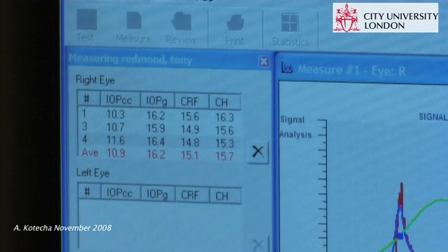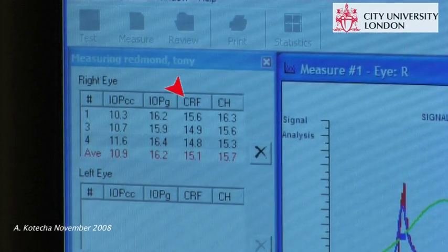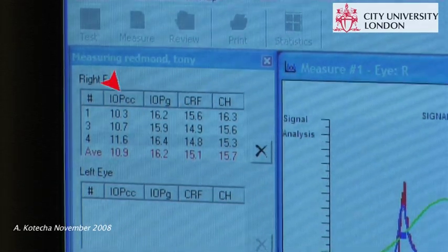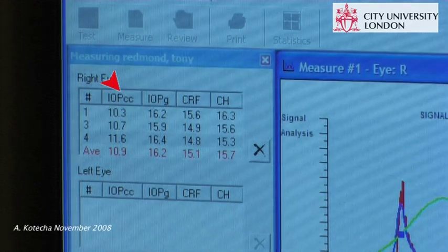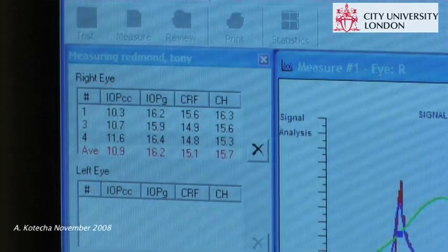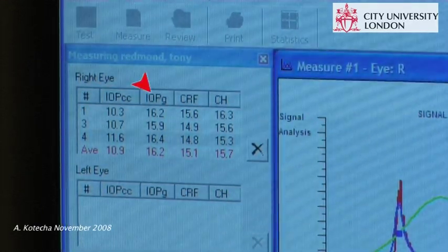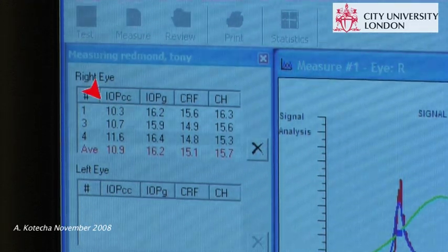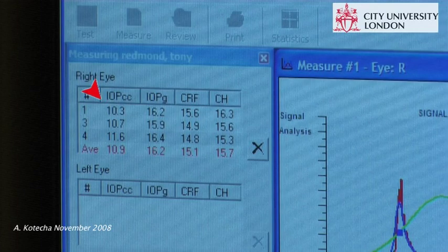Reichert have also determined a corneal response factor which they incorporate into the IOP reading, resulting in a corneal compensated IOP measure. On this printout, IOPG represents the standard Goldmann equivalent IOP reading, whilst IOPCC is the compensated one.